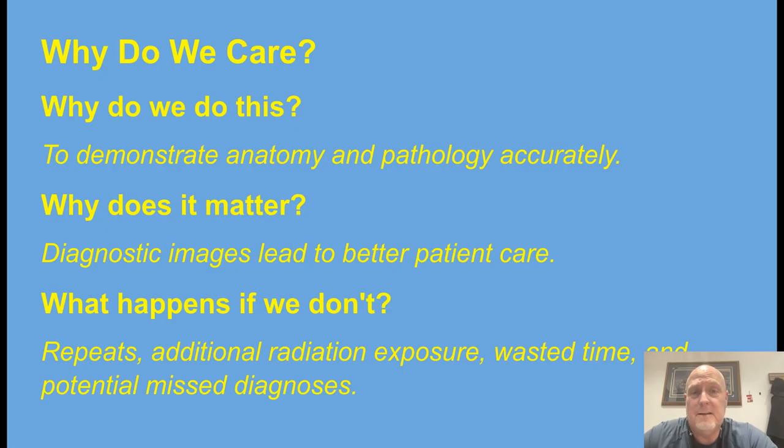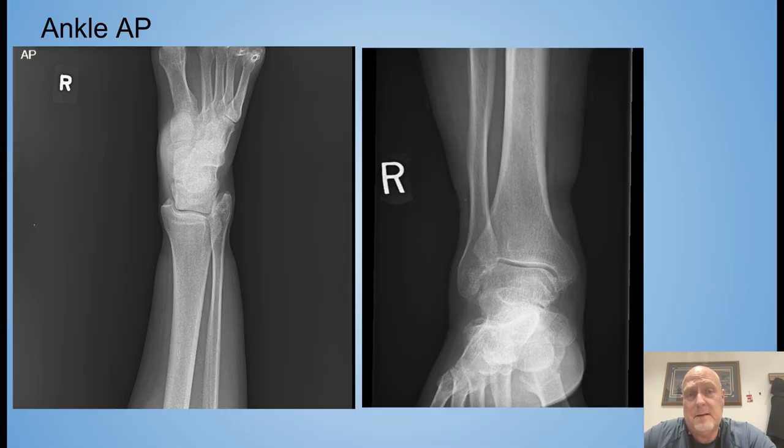So let's get started. And today's episode has more to do with patient annotation, or having the patient anatomically correct, as opposed to any contrast or density issues. These images are all pretty good. I just wanted to bring up one point that I'm seeing a lot of, which is anatomy that isn't posted correctly, or it doesn't look anatomically correct for the provider or the radiologist.